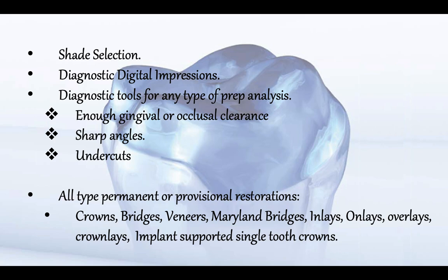Diagnostic digital impressions are also possible, and you will be able to scan and then 3D print, or scan and then at least see on the actual screen how your bite is, how the wear facets are, how the patient bites, and everything related to the cast models. Instead of seeing it in analog phase, you're going to see it on the screen.